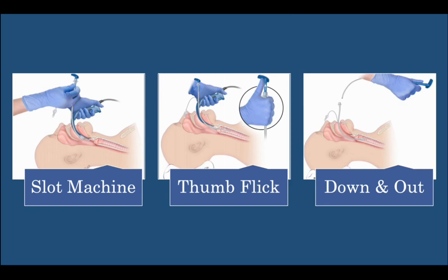So as you're walking down the airway, your hyperangulated stylet needs to follow the direction of your hyperangulated blade. Once the tube comes into your field of vision right below the arytenoids, you're going to pull back like a slot machine. So think about holding this stylet in a thumbs up or overhand position. Rock back like a slot machine.